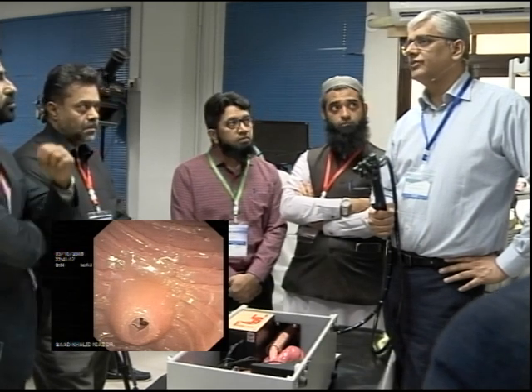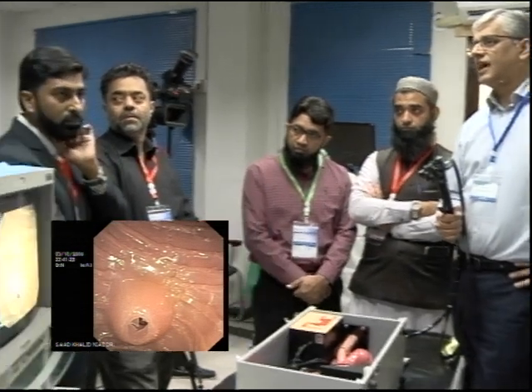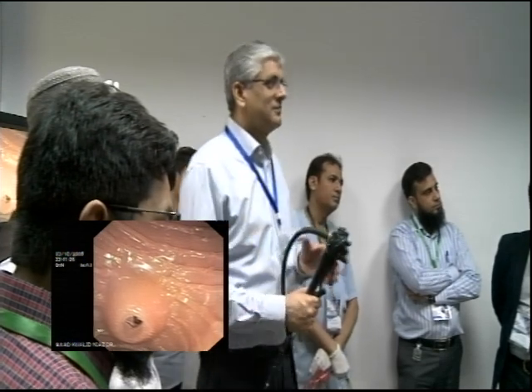Would you have a different view? Sometimes it helps. I think it depends on the situation. So for trainees, I find if they lose position, it's tough. But in those situations, usually you line it up for them, lock it, and say, okay, we'll now try. But not yet.